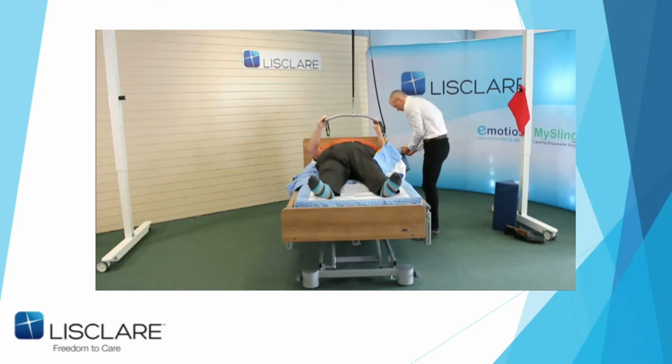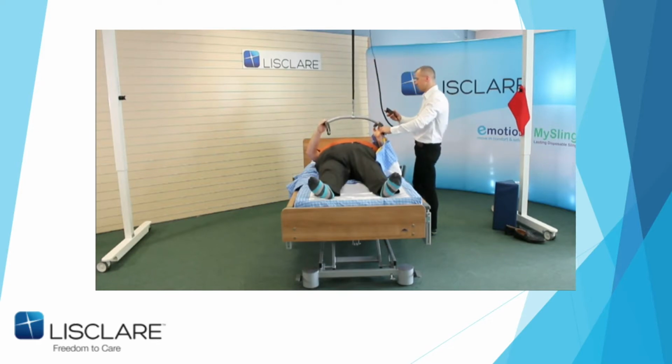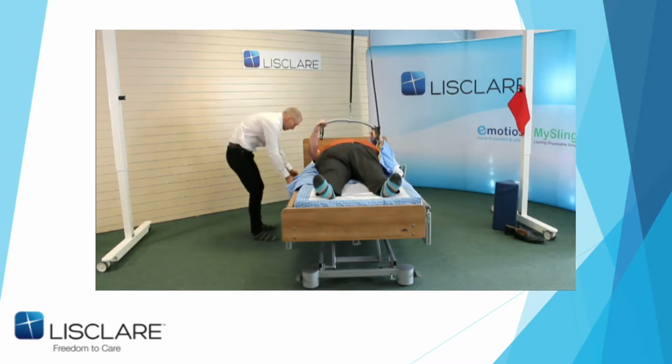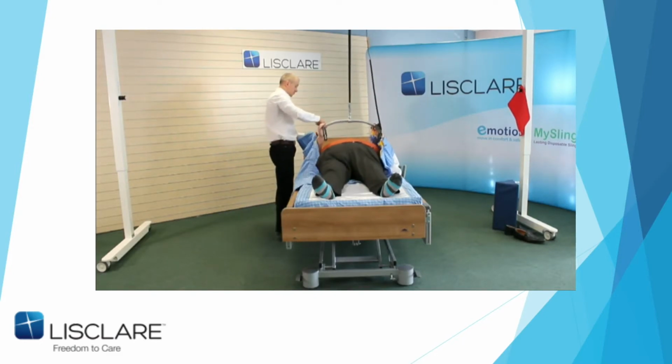Now, in the person's house, especially if it was being nursed myself, I'm sure the OTs would agree that I would have an H-system overhead hoist built in. And I've done this with a 44-stone lady, whose husband was the sole carer, who weighed about 10 stone. So that gives you an idea of what you can achieve with an H-system hoist.